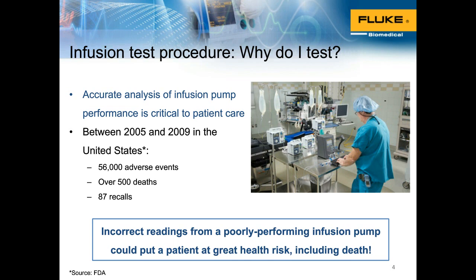The FDA issued some guidance several years ago. We haven't really seen many updates since then, but it's still startling that in a period of 4 years that they tracked, there were 56,000 adverse events and over 500 deaths, including 87 recalls associated with infusion pumps. Needless to say, it is critical for us to make sure that these devices are operating optimally, because incorrect readings from a poorly performing pump can put a patient at great health risk.